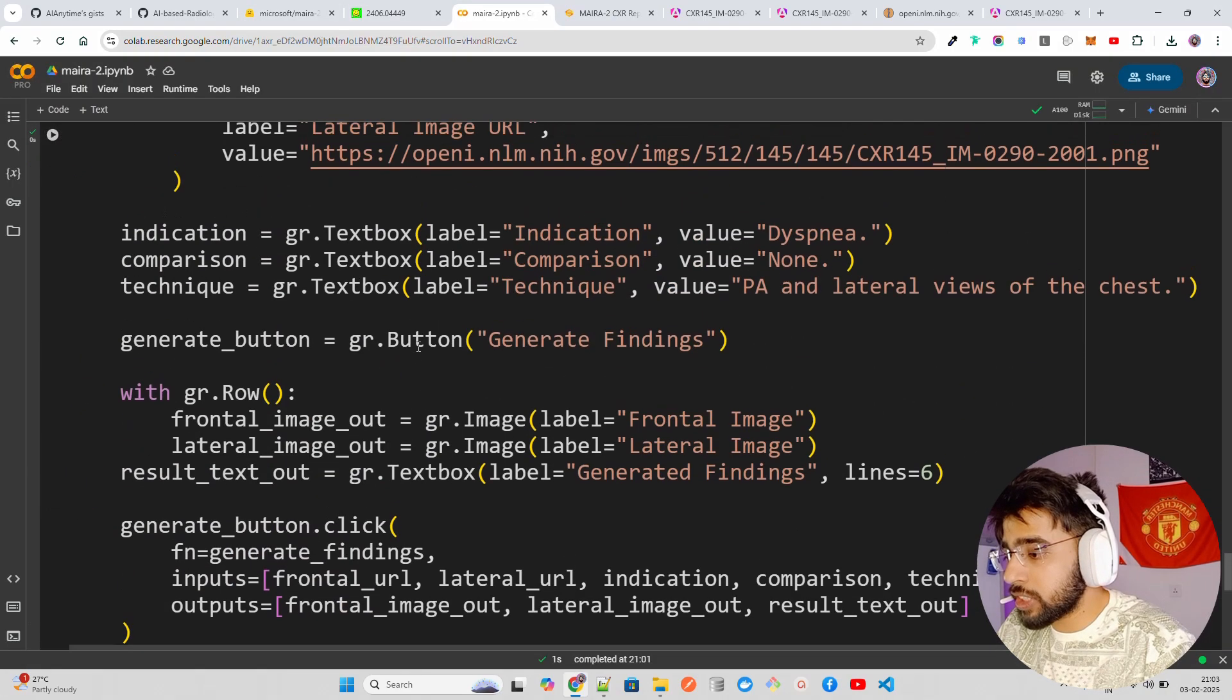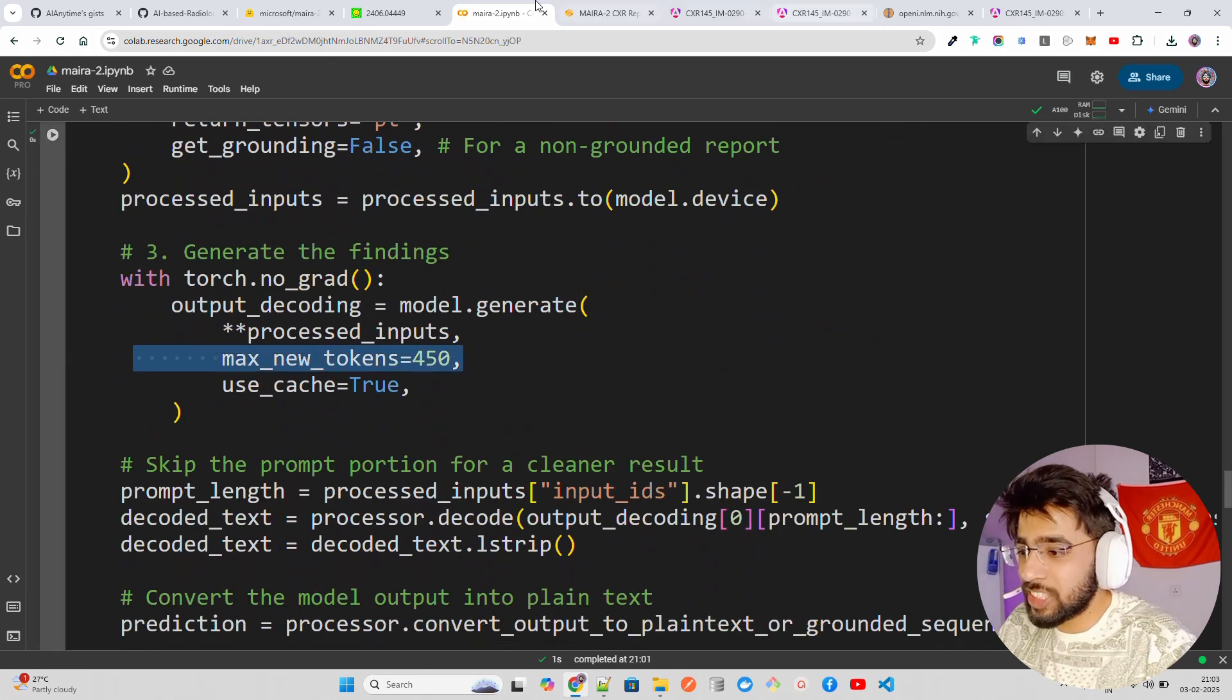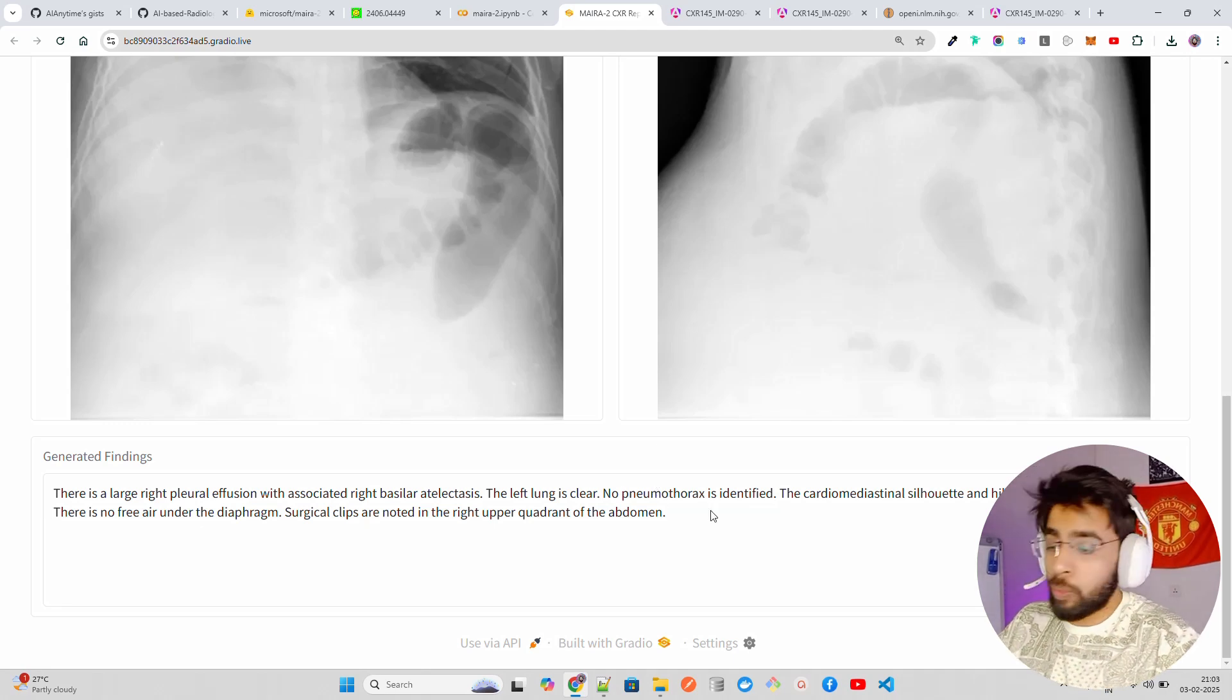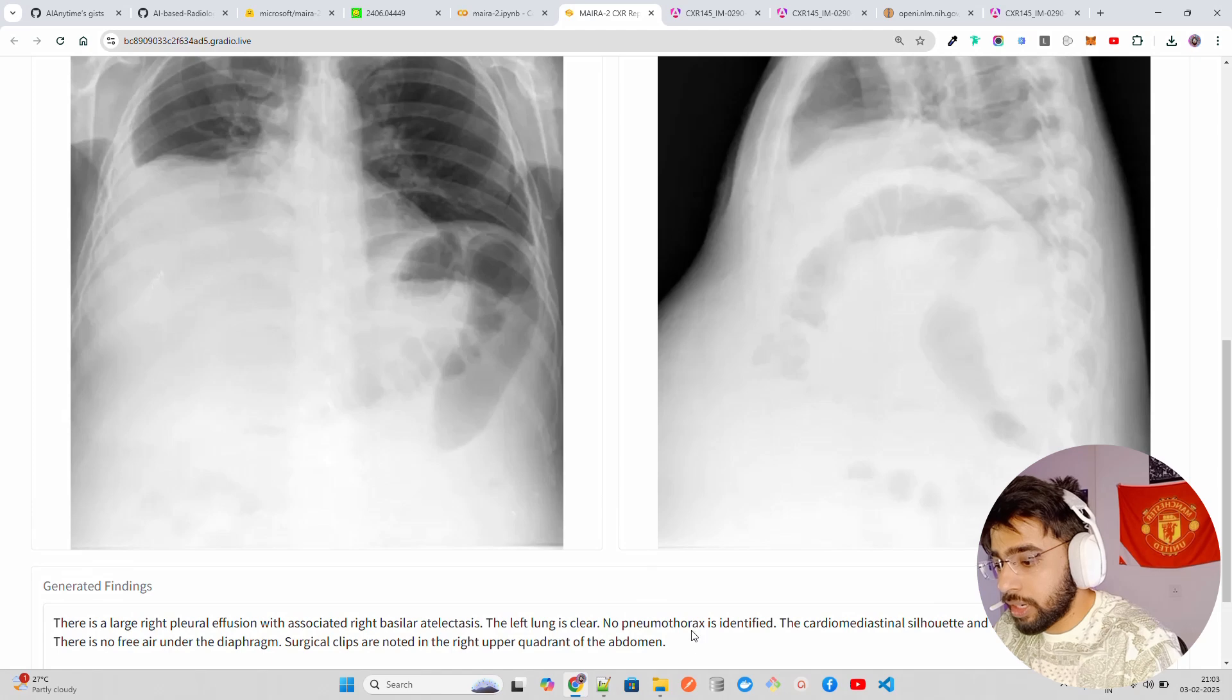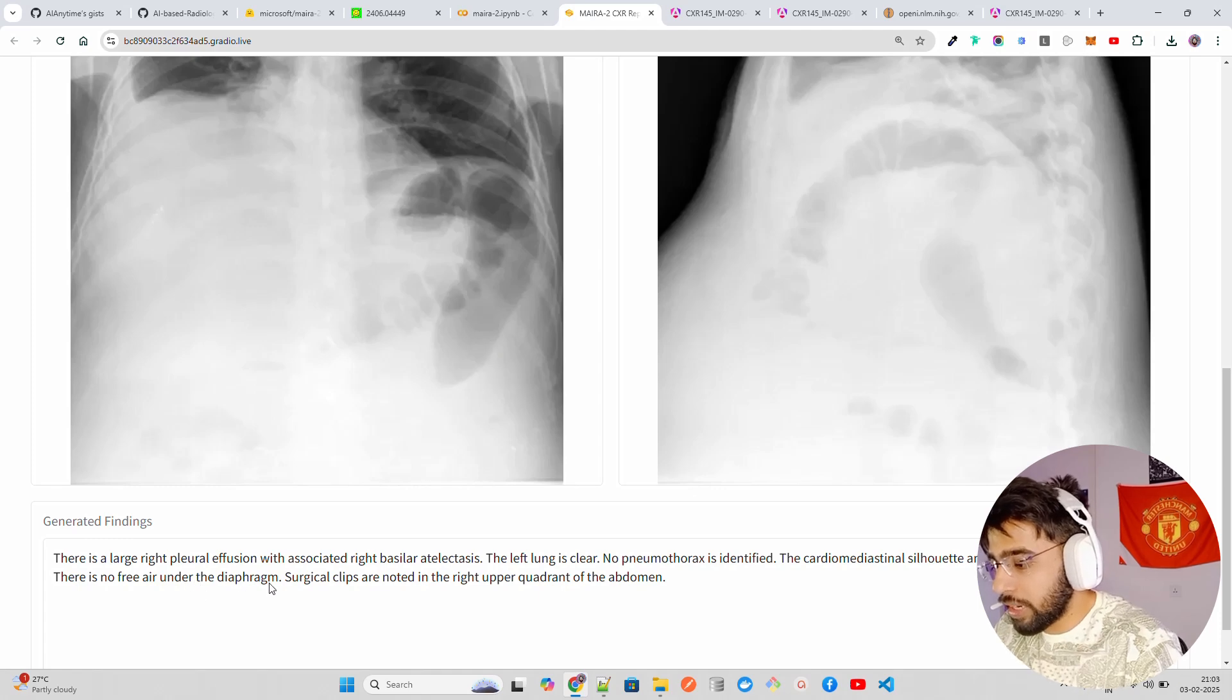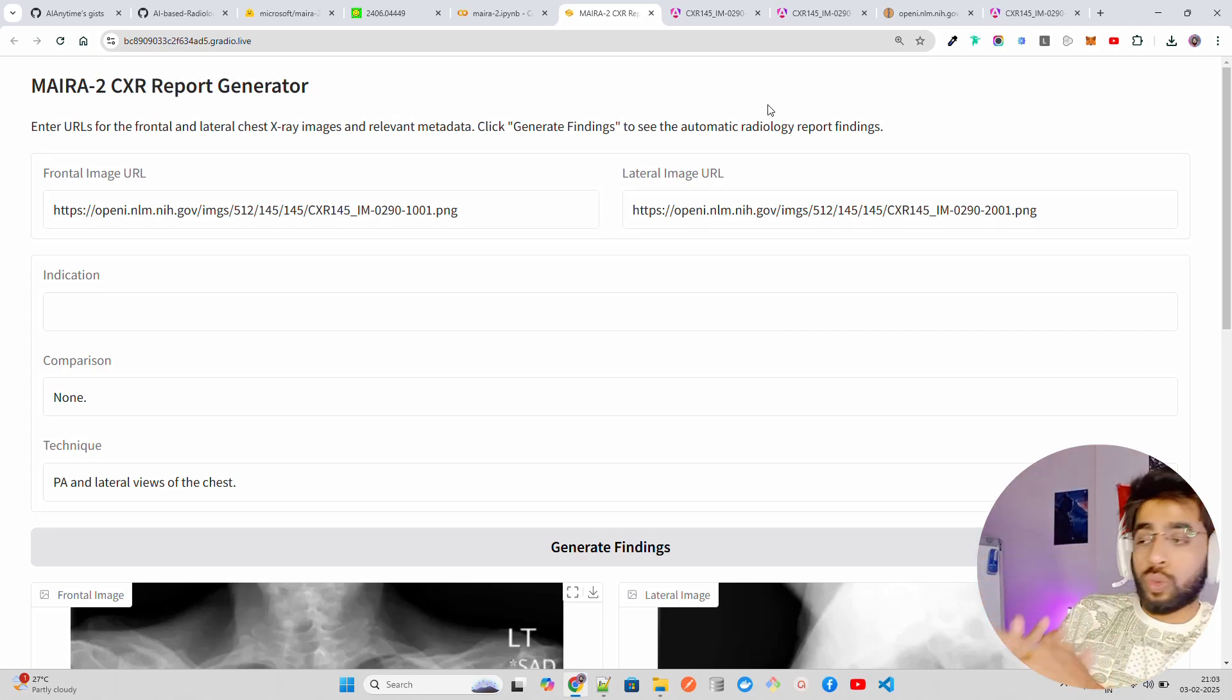You can make sure that you can write custom prompts as well to tailor this in your style. It says surgical clips are noted in the right upper quadrant of the abdomen. Probably about this or something. There is no free air under the diaphragm or something, the left lung is clear. So you can basically use MAIRA-2 to help you find anomalies or generate some findings that will help you in your work, in your research, and it's really intuitive to use it.